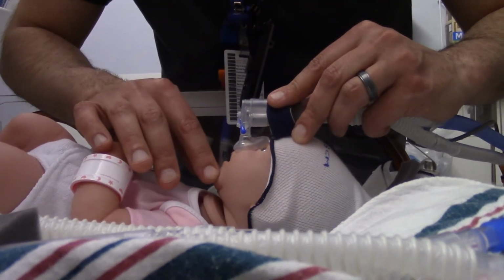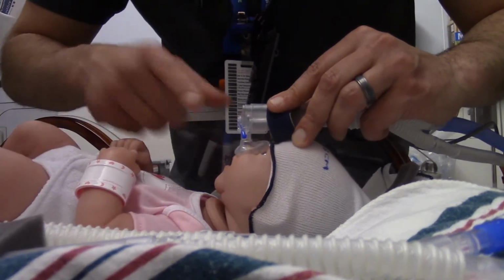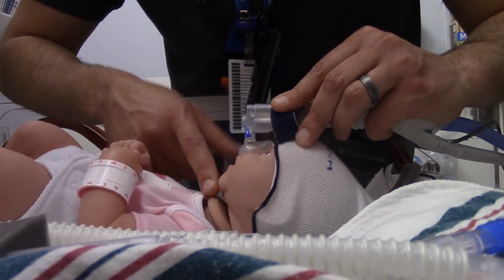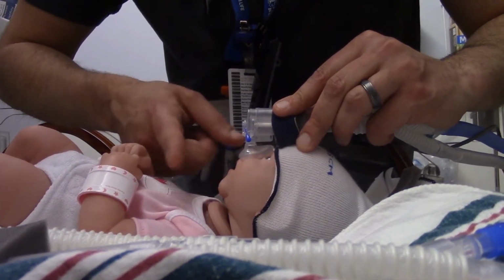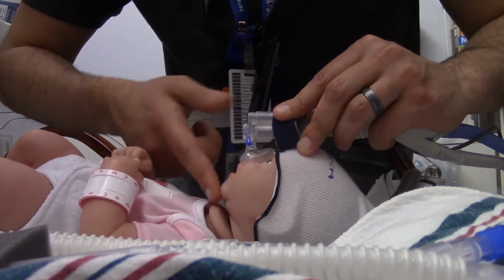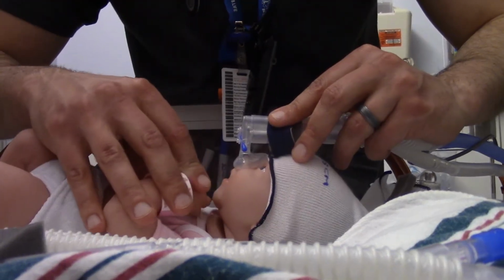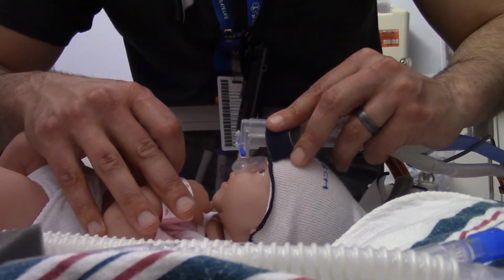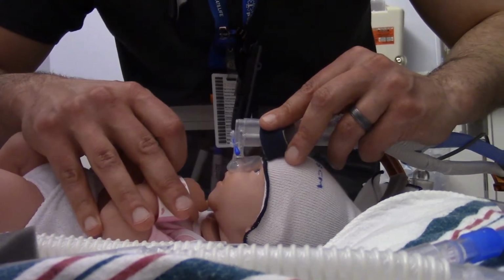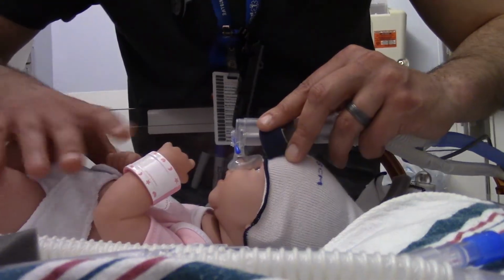Other older gestational babies, into that 32, 33, 34 realm, usually they have the motor skills and they're looking for the nipple on the mom's breast. The binky serves as that, or positioning wise, if you need to, try some different forms. You can tuck the child's hand up underneath their chin. That's a position of comfort to help close the mouth and keep the closed circuit.